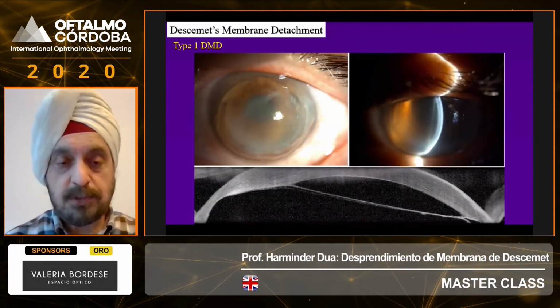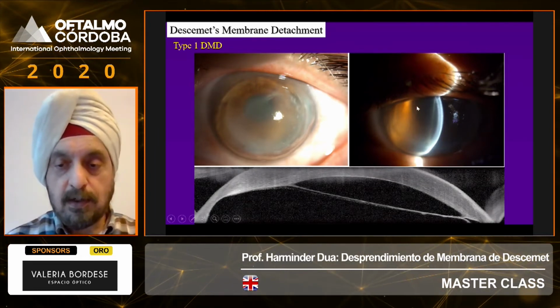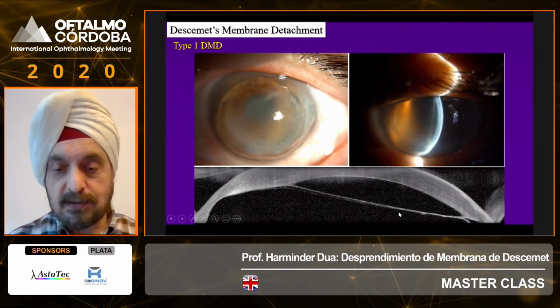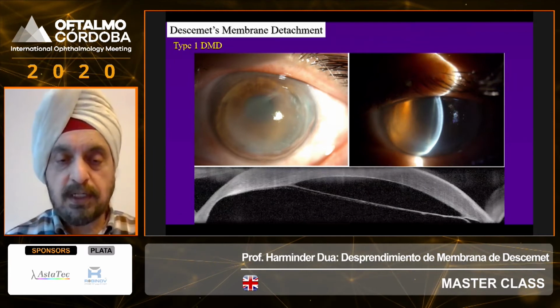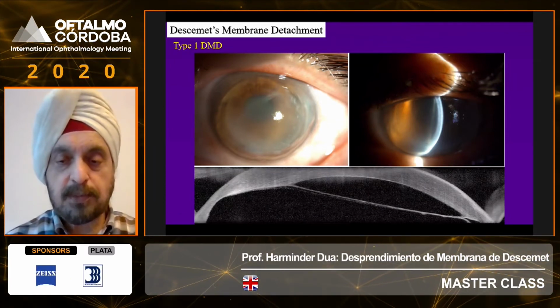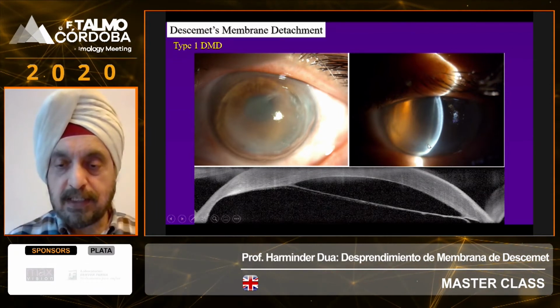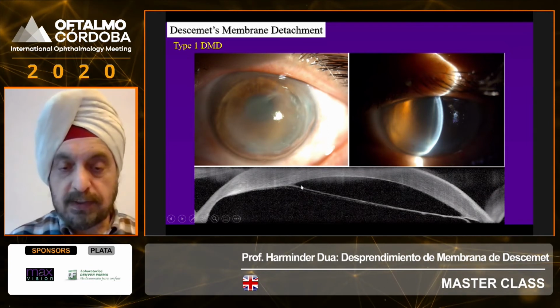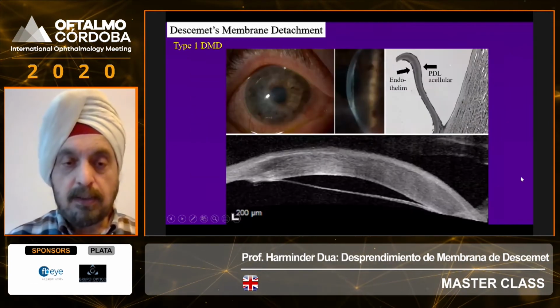So we'll take a look at the picture over here. Chronic post-operative corneal edema. On the slit lamp, you can see a line, and this is the classic appearance of a type 1 detachment: pre-Descemet's layer, Descemet's membrane, endothelium. This will always appear like a very straight line, like the chord of a circle. It's very taut, a very tight line, like you see here and here.